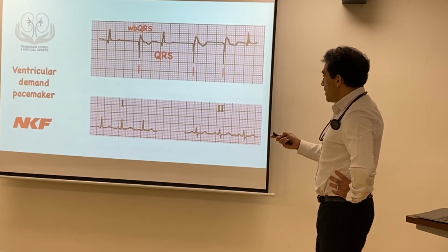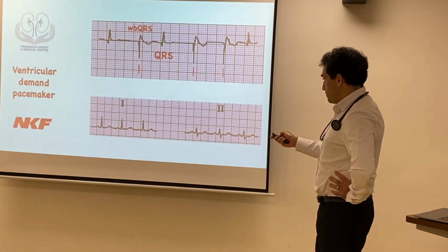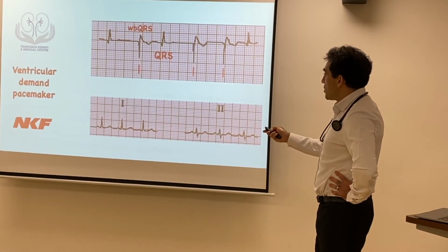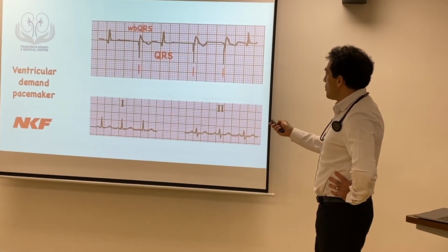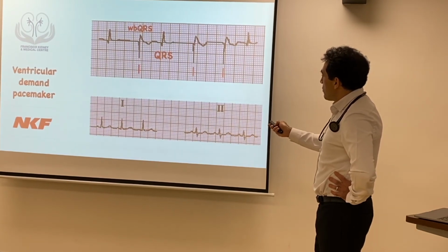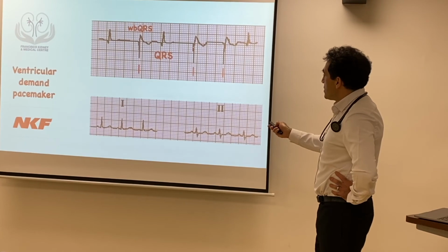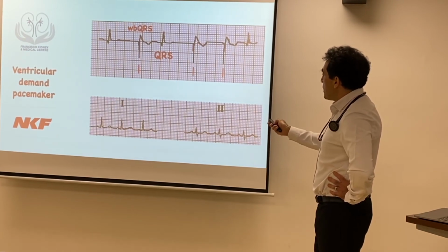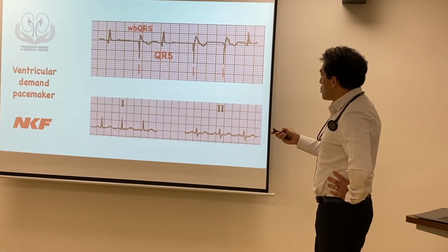This is a ventricular pacemaker. So the spike happens just before the QRS. So probably there are no P waves, or the P waves are not conducted. So then it's located in the ventricle, spikes and contracts.